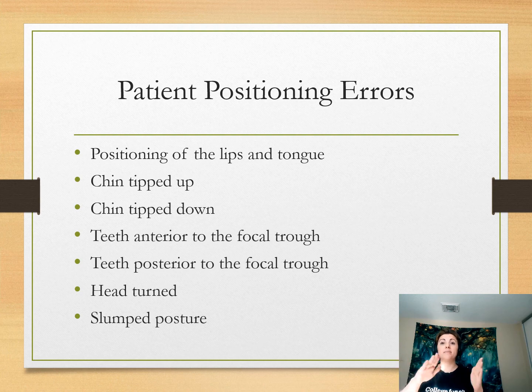When the PID, the tube head, comes around the back, it'll actually bump into the back of their neck or the back of their shoulders, and it will cause an issue. It'll cause a giant white line in the center of your image, and you do not want that. So make sure they're standing up straight, because if they're slouched, it will be bad for you. Even the very smallest error can cause a distortion on this. So make sure you're being very particular when you're setting them up. It's not uncomfortable for them to be there, so make sure you get them in just right.